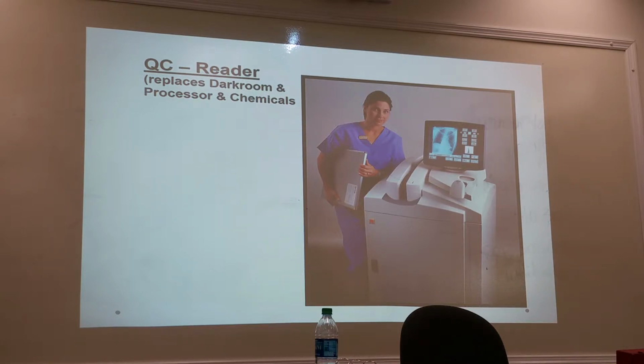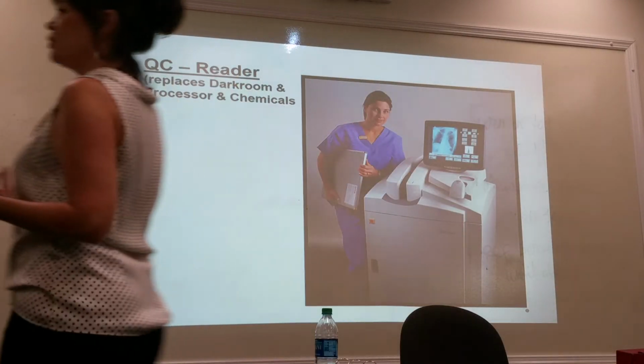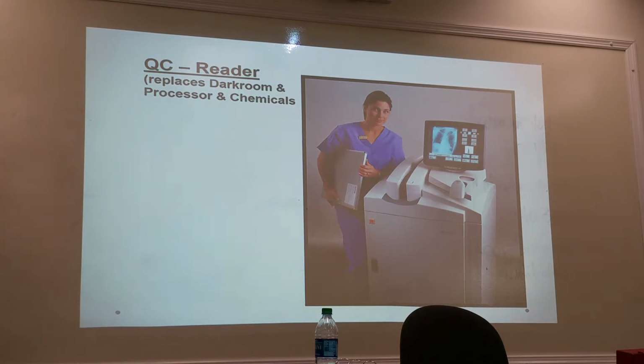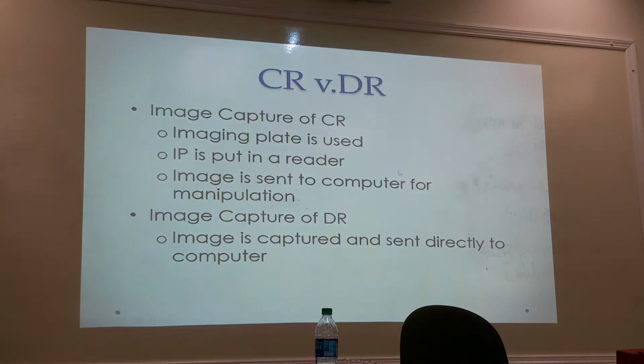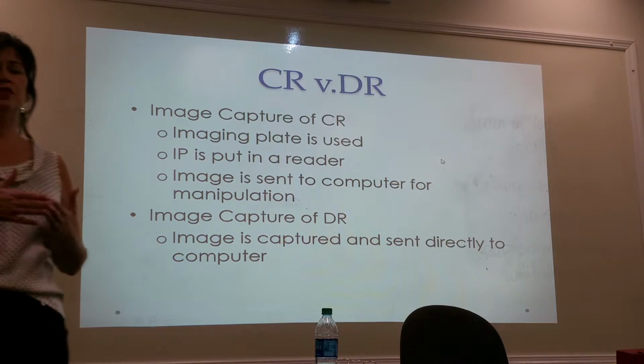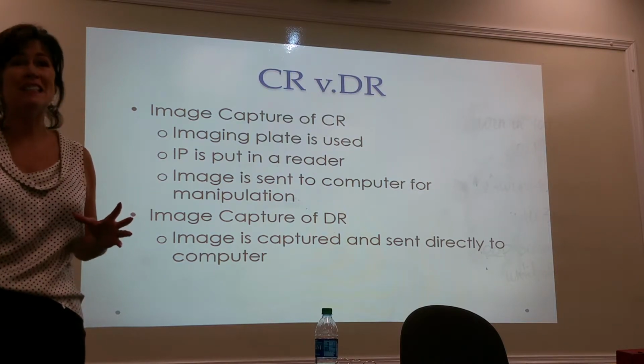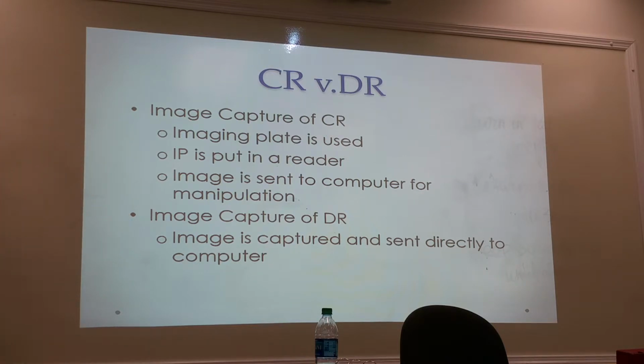In a hospital like St. Jude, we are going to provide them with top-notch, up-to-date caliber equipment. So it was, that department administrator felt like they were pressured to do that because of the patients demanding that. And so now everyone's doing it, and now the transition was all CR, then a little bit of DR, and now we're going fully DR. So we're working our way there.